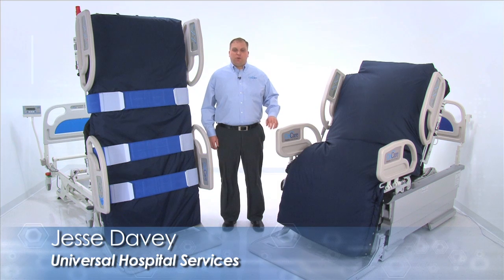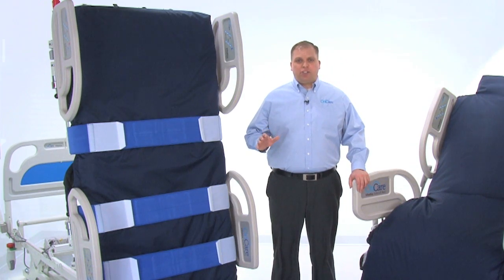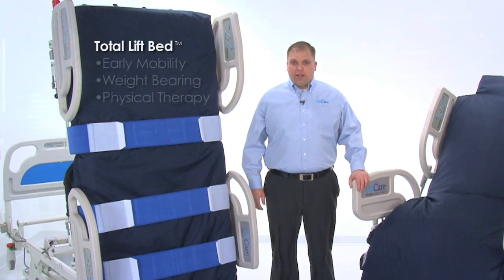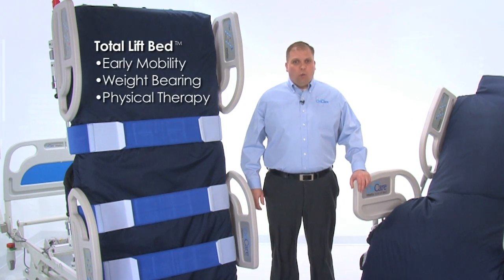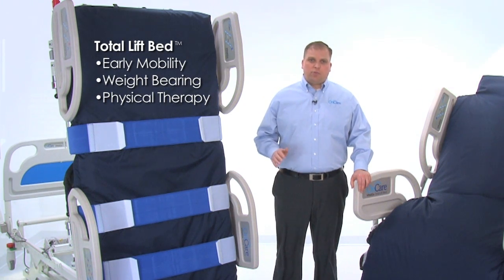Hello, this is Jesse Davey with Universal Hospital Services. Today I'll provide a demonstration of the OnCare VitalGo Total Lift Bed, a revolutionary patient care platform offering unmatched therapy capabilities for progressive early mobility, weight-bearing, and physical therapy that's simply not possible with any other hospital bed.